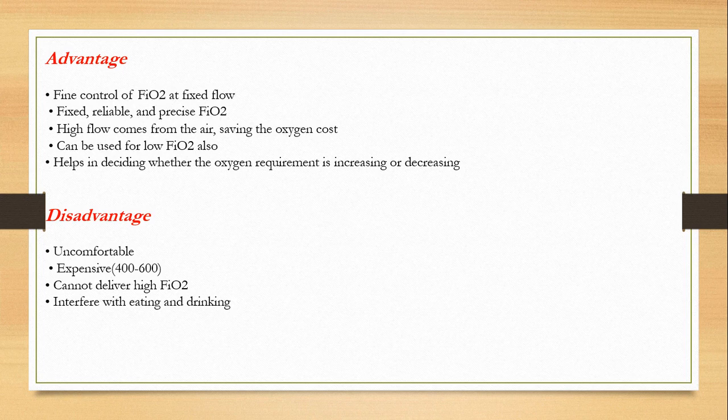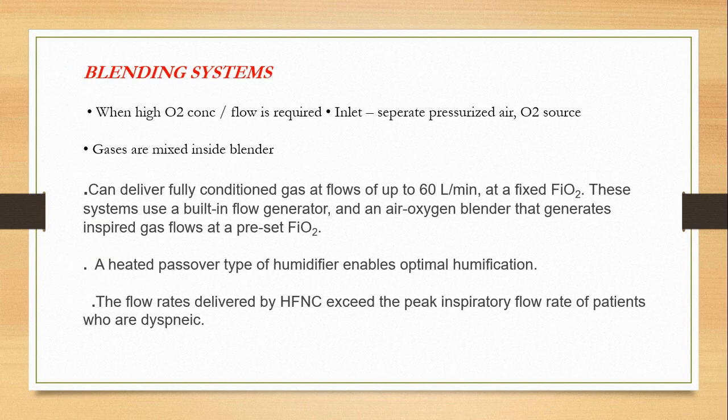So the advantages, again: there is fine control of FiO2 at a fixed flow. It is reliable, it is fixed. High concentrations of air can come into this, so it saves the oxygen cost. The disadvantages are that it is sometimes uncomfortable, expensive, and cannot deliver very high FiO2s.